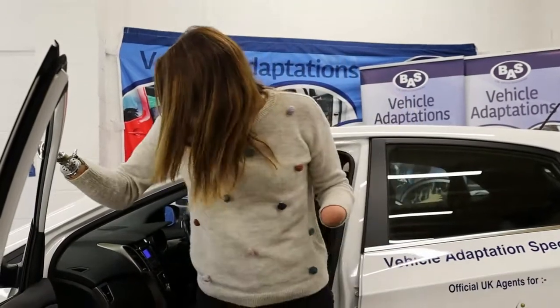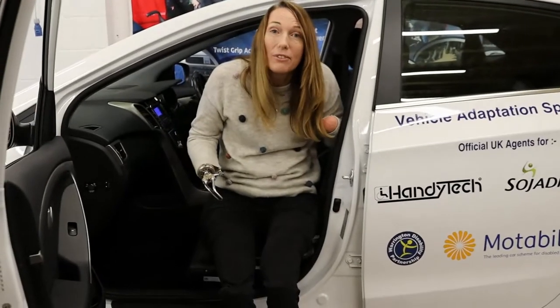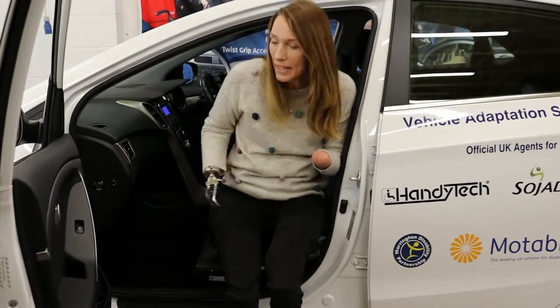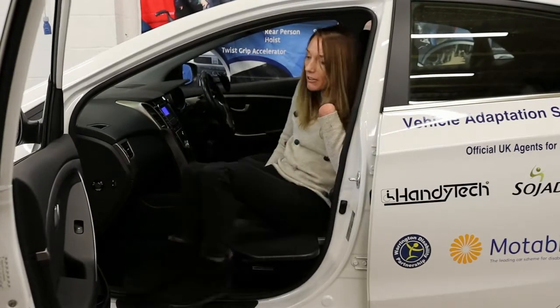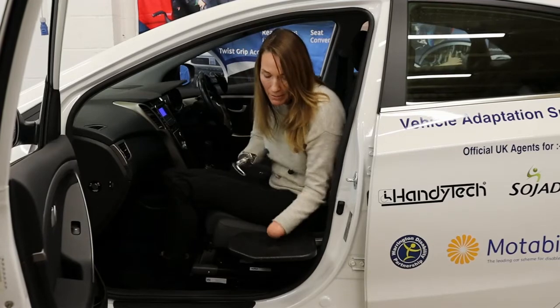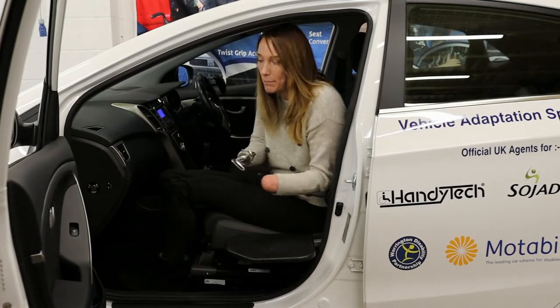This is the BAS manual transfer plate, which, like the electric one, helps you to get in and out of your vehicle. Instead of falling back into the car, I've been able to sit on the edge and move myself in really easily. This one wouldn't be very useful for me because I'd find it too heavy to lift, but for people that can, it's really easy — just lift up and pop it in the footwell when you're on your way.